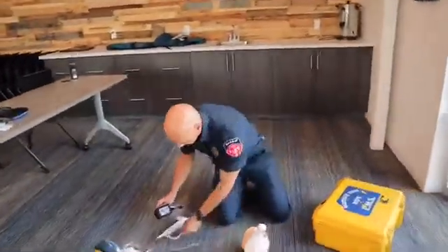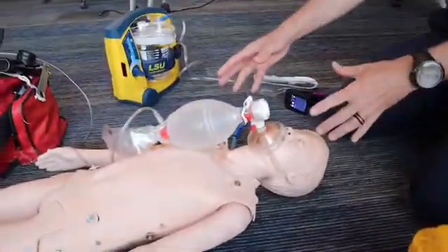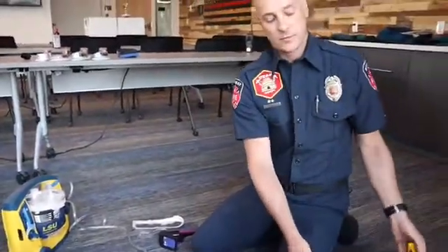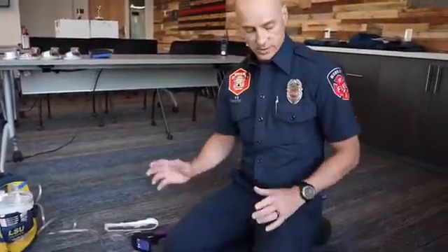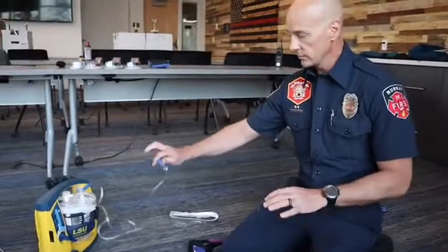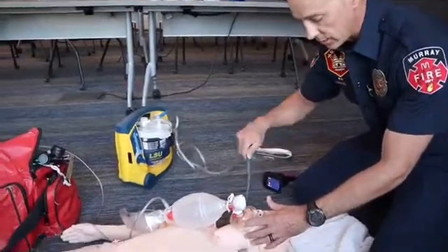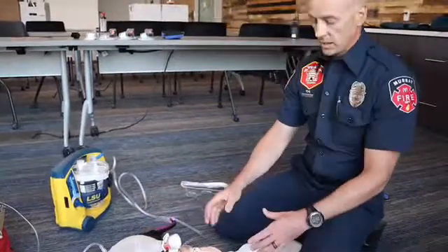For purposes of this training, we have a pediatric blade with the camera. We're going to say I have a partner who has an OPA inserted into the patient's airway and is bagging and oxygenating the patient. The real key to success for any intubation is taking time on the front end to prepare. For instance, we have our suction ready — tuck the Yankauer just under the shoulder so anytime I'm manipulating the airway I can grab it and suction secretions or blood.